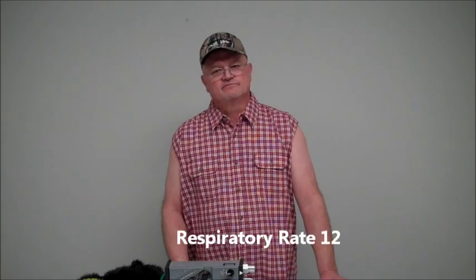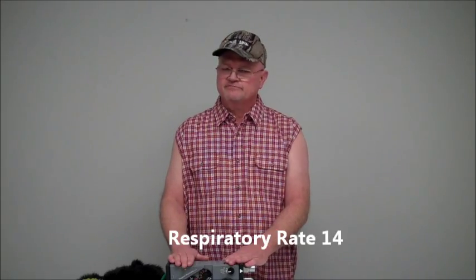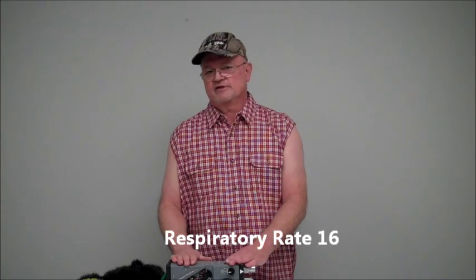Initially we had the tidal volume set at 8 cc's per kilo. If you're happy with that, you're getting good chest excursion and your peak inspiratory pressures are less than 30, then you probably should change your respiratory rate. Initially we had it set at 12. Well, if you still have high levels of carbon dioxide, turn it to 14. Still having high levels of carbon dioxide, turn it to 16.